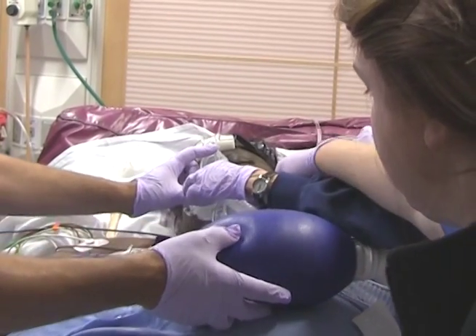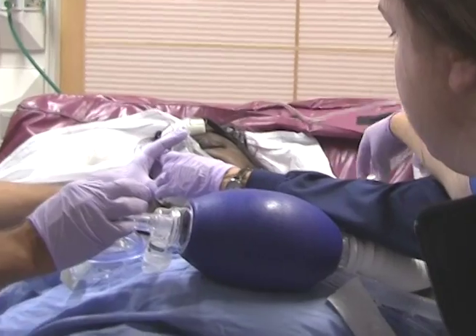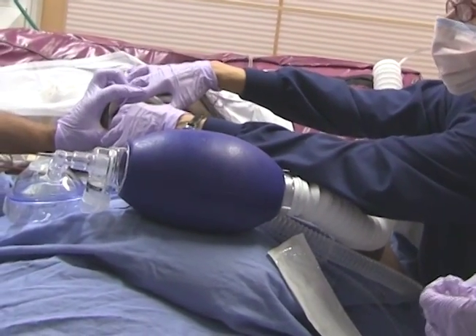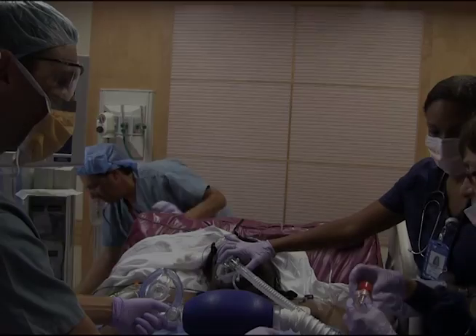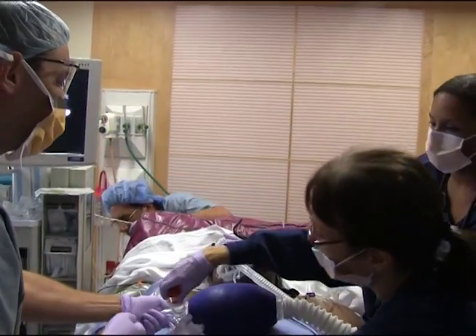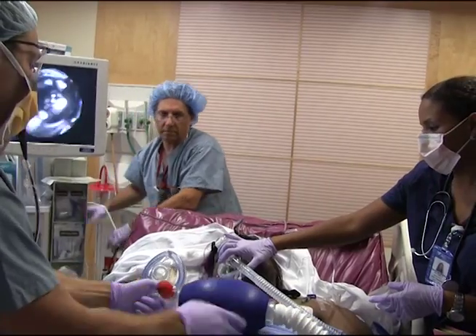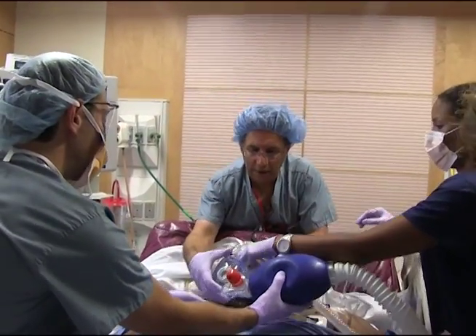The threatened adult airway response team has arrived and has decided to perform a flexible intubation scope aided intubation in her semi-awake state. Local anesthetics have been applied to the airway by holding the patient's tongue and applying 200 milligrams of lidocaine solution via an atomizer.